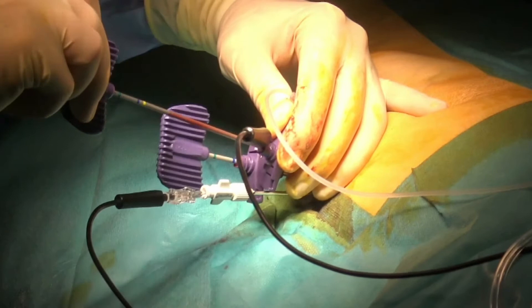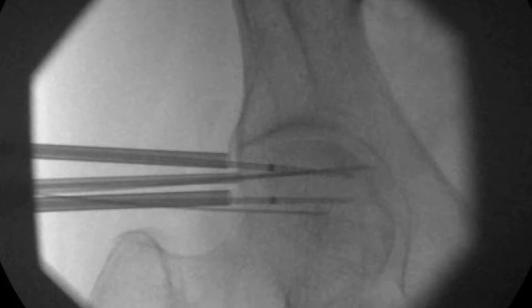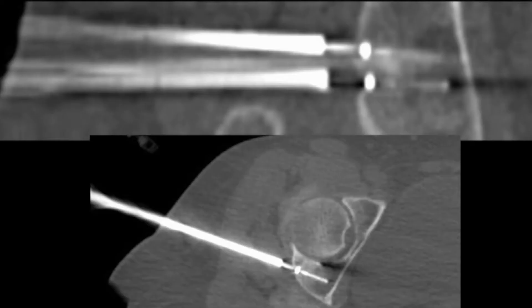The two 20 mm active tip radiofrequency ablation probes are connected to the Osteocool generator. The drills are removed and the RFA probes are inserted through the introducer. As they are all Osteocool-compatible devices, there is no risk of interaction between the active tip of the RFA probe and the introducer. A 3D acquisition is performed to check for the proper position of all devices. Multiplanar reconstructions show that the metastasis is located in between the two RFA probes, so the ablation should cover the lesion with safety margins. The thermosensor is correctly located just posterior to the cartilage.